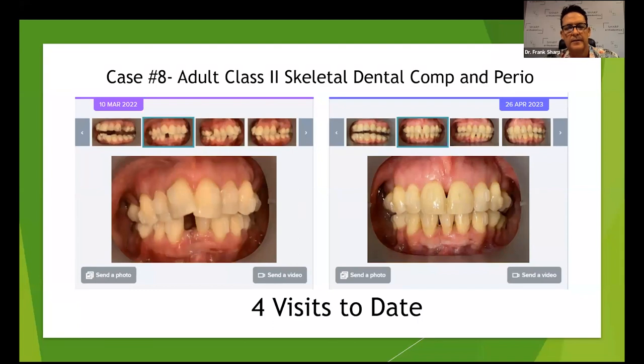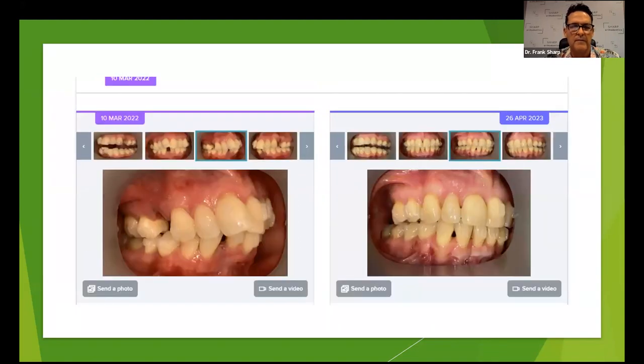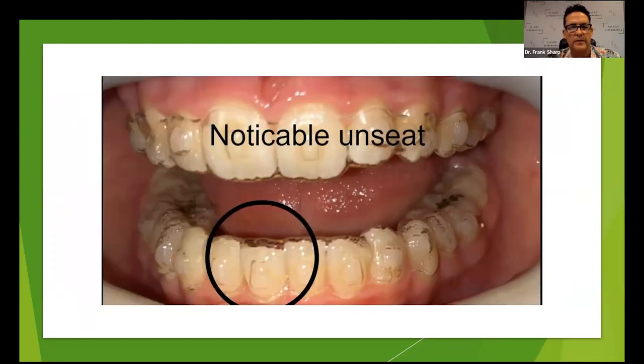This case, I do a lot of crazy extraction patterns. This particular lady needed surgery. I took out two upper bicuspids and a lower incisor because she refused to do surgery. She had some perio issues. I think we've seen her four times, probably five times up to this point, because this was last taken in April. But she's happy. Her teeth look great. She's happy as a clam. Treatment's going well. And she hasn't had to come in very often because she lives about 45 minutes away.